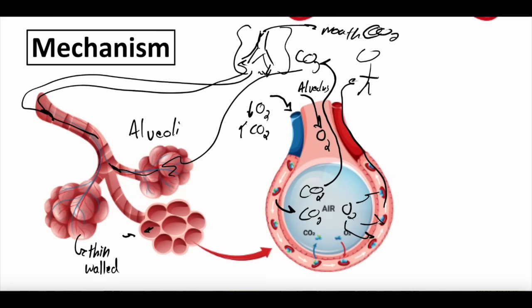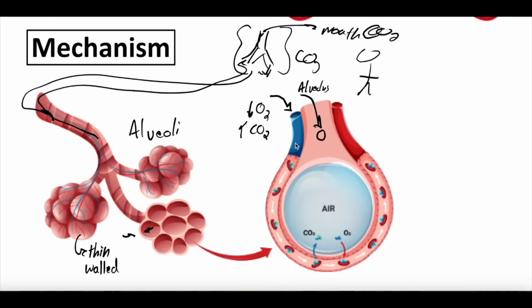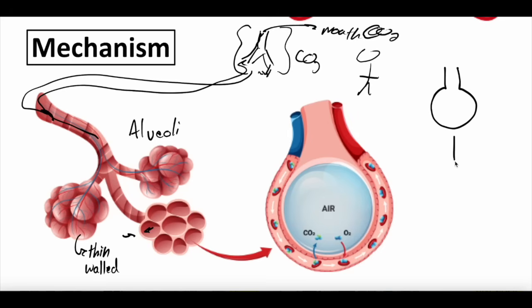When you're on a ventilator, what's happening is the ventilator is pumping that air in and out of the trachea, bronchi, bronchioles into the alveoli. And what happens is when you have lung disease, you get different areas in your lungs that are patchy and collapsed. And it's really important for this alveolus to be perfectly inflated, because if it's underinflated or if it's overinflated, all this can cause damage to these really thin-walled alveoli. And different parts of the lung experience different pressures. If I have pneumonia in one part of the lung, that might be experiencing things differently than the part of the lung that doesn't have disease.